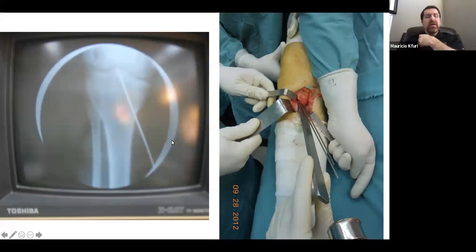I would say I agree with Michael. I would like to say that it's important first to understand where the main fracture plane was located originally. So then you can go guided by C-arm and have your K-wires placed exactly following that plane of deformity.